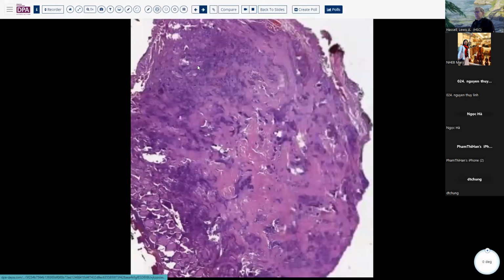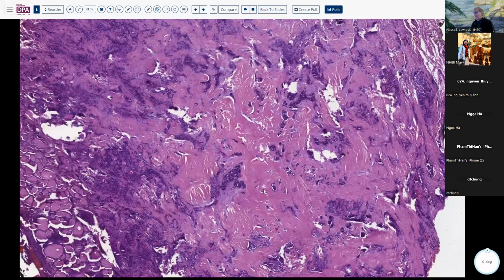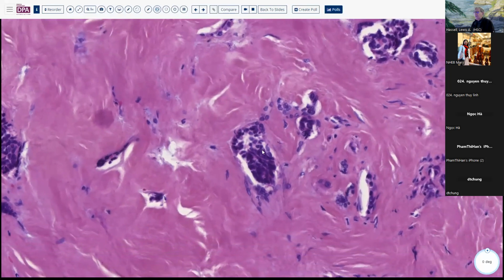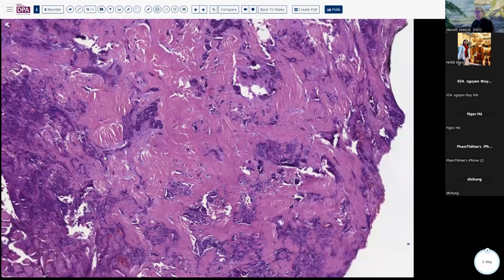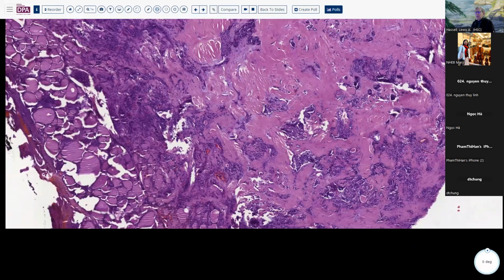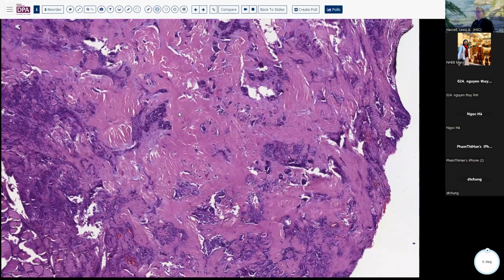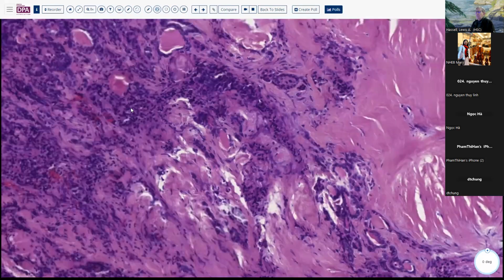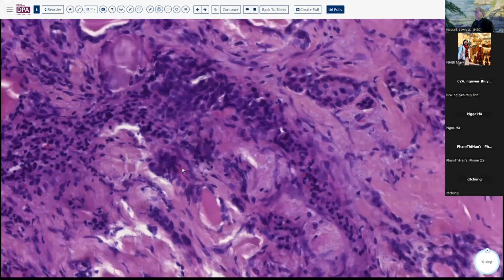Now, in contrast, this next case has lots of amyloid. In fact, it's so sclerotic here that you might almost wonder if this is a lymph node that's become sclerotic or some other lesion because it doesn't really look like thyroid parenchyma, except out here at the periphery. So the amyloid can be quite variable, present, absent, abundant, minimal, and the morphology of the cells can be quite variable.